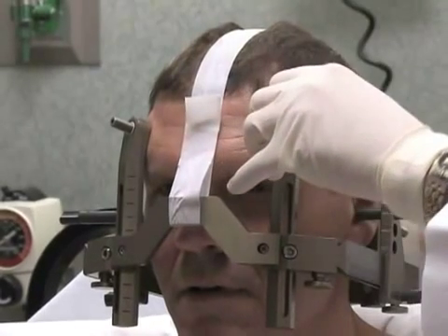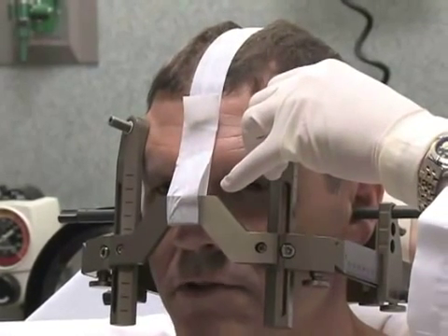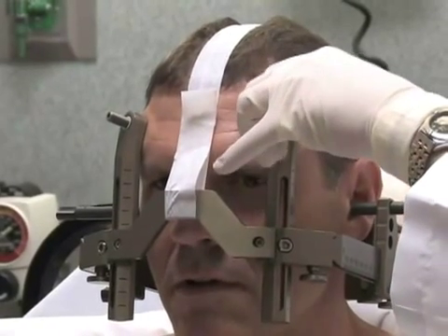Once numb, the pin screws are inserted and tightened. You may feel some pressure as the pins are tightened down.